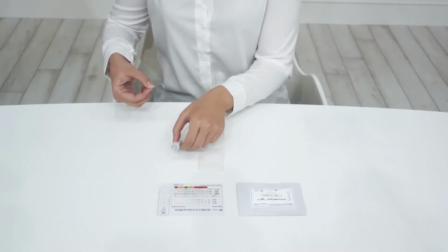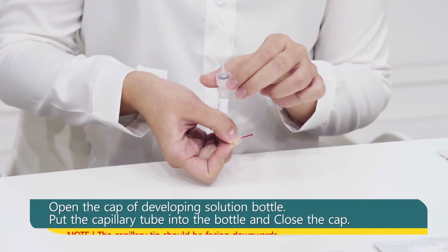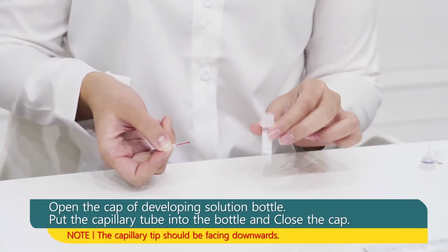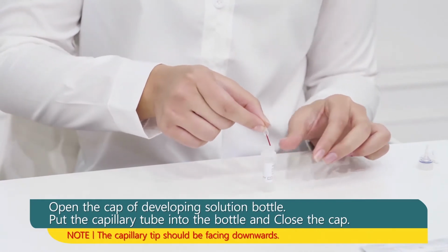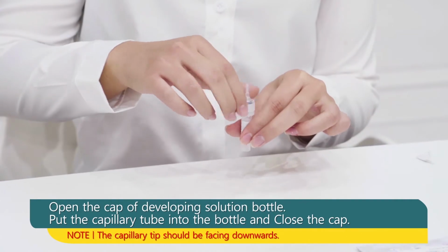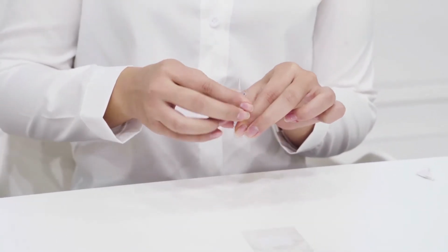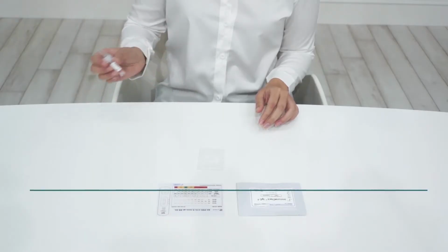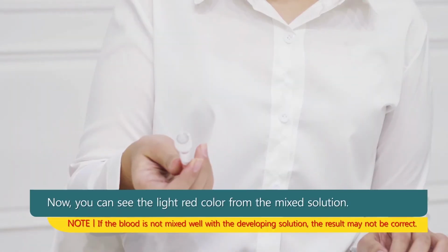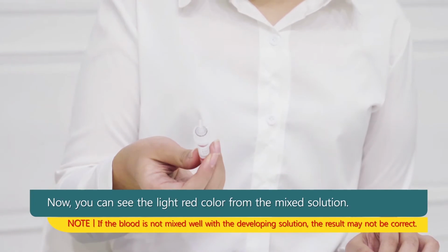Sixth step, open the cap of developing solution bottle and put the capillary tube into the bottle. Close the cap. Seventh step, gently invert the bottle 15 to 20 times. Now you can see the light red color from the mixed solution.